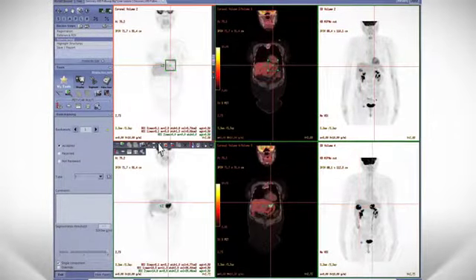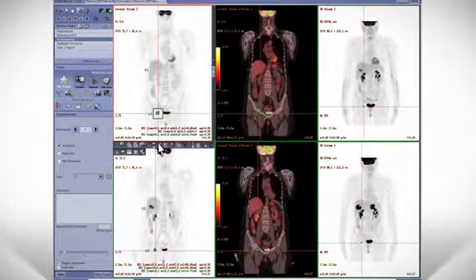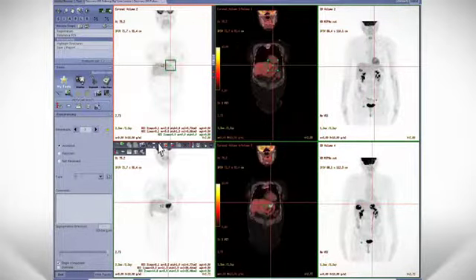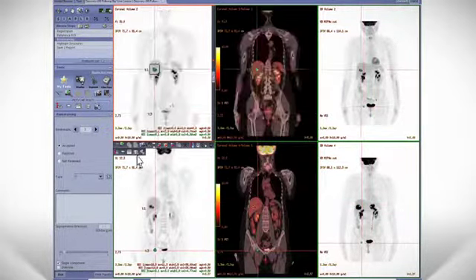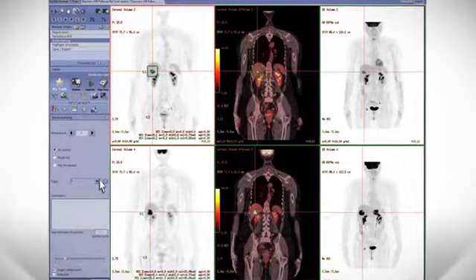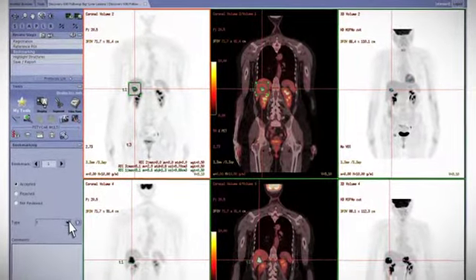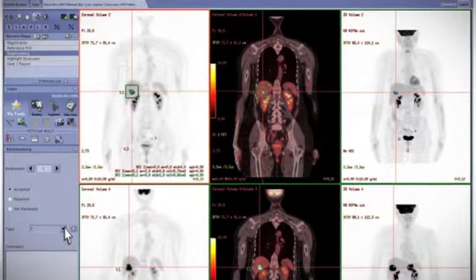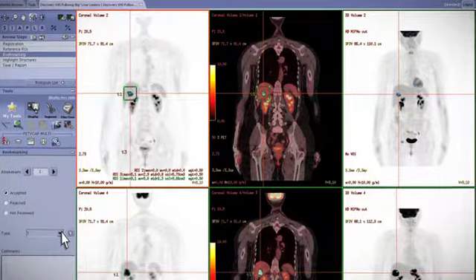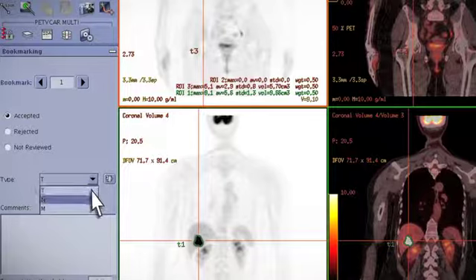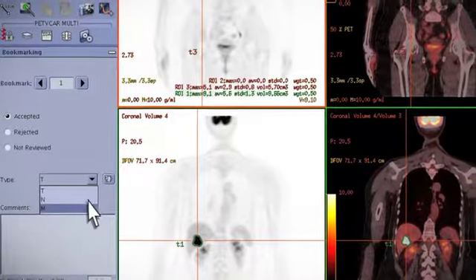This propagation takes the baseline contour and creates a region on the follow-up exam, so we can see if the lesions have responded to therapy or have progressed. We can review each bookmark from the baseline study to the follow-up study, looking at the contours where the physician accepts or rejects the bookmarks. The bookmark can then be identified as a tumor, node, or metastatic disease.